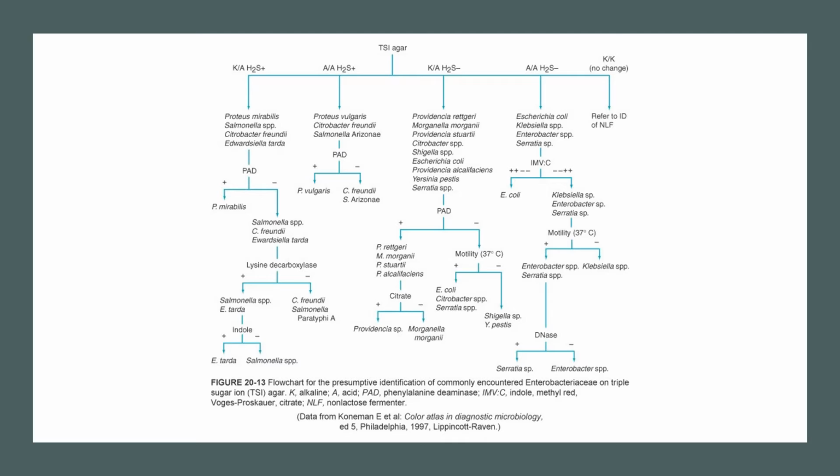Wow! So the next step is this big flow chart at the end of your Enterobacteriaceae lecture, right? Okay, no worries, we'll break this down step by step. You already have your lecture on different biochemical reactions, the kinds of results, and the principles for each of those tests.